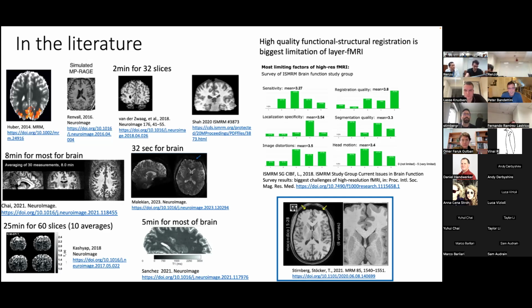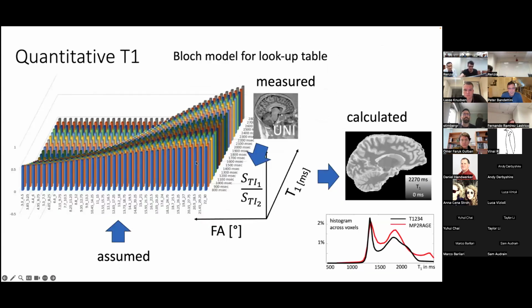Then the readout lengths make sense. The assumption is hard. We had this as a side note in the abstract where we described this more. I think because we are in the layer fMRI session, nobody cares about quantification, so we made this very short. And the assumption is that, following the universal pulses, each person has a huge spatial variance of the flip angle. In the center, it's like a factor of 3, sometimes bigger than in the periphery. But that pattern is extremely consistent across people.